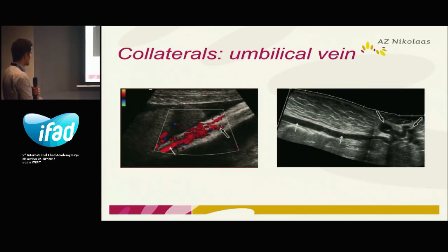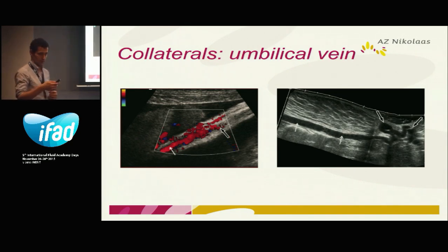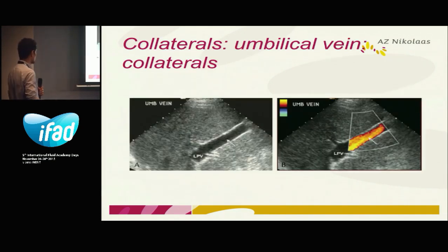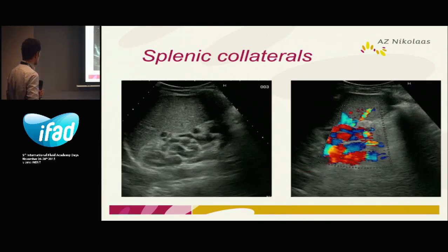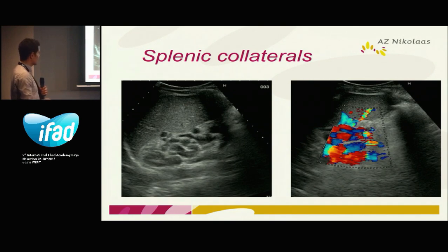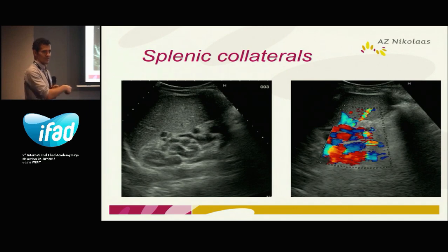Sometimes it gets even larger — this is the caput medusae that we know from physical examination, and you can follow it going to the umbilicus. This is severe portal hypertension, running outside the liver to the umbilicus. Sometimes we can appreciate collaterals, especially in patients with hepatic encephalopathy. The spleen is enlarged, and here you see all kinds of veins in the splenic hilum — this is clear portal hypertension with portal-systemic collaterals.